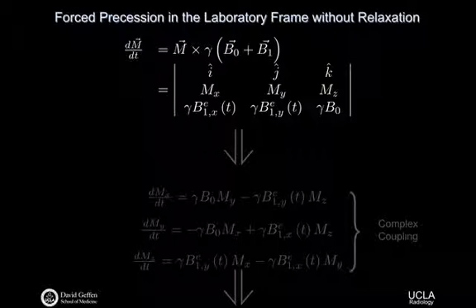And we just saw in the previous slide the form of the B1 field. A possible form, at least, is that it has some function, some envelope as a function of time acting on the I direction, if you will. And it also potentially has some term acting on the J direction. The B1 only acts on the I and J directions. It's perpendicular to the K direction. And then we have to give our B0 field in here again as well.